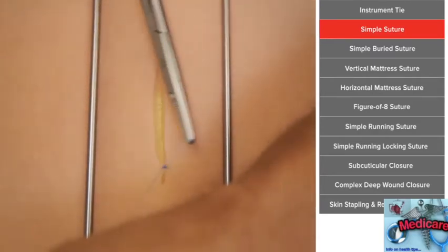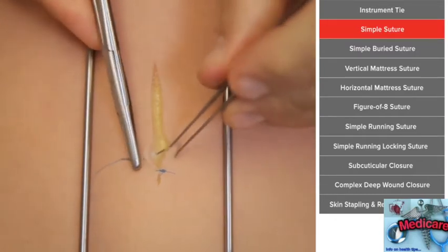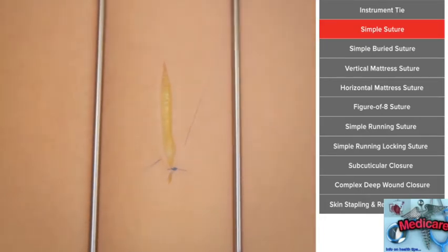So that's why I like to do it in 2 and not try to just run the needle all the way across. Do the instrument tie, as I've already taught you, and see how nicely the skin is approximated. And you'll see as you start doing this more and more, you'll just get faster and faster. It is an acquired skill.